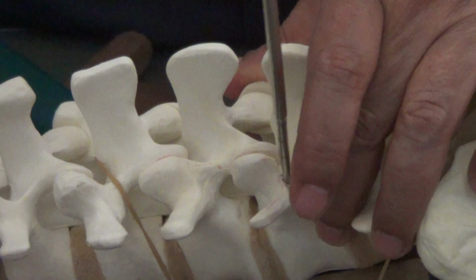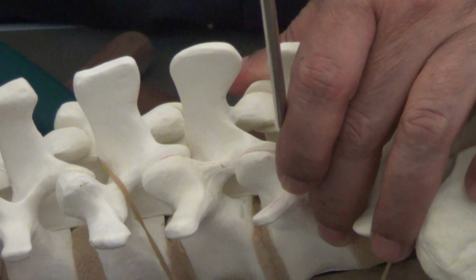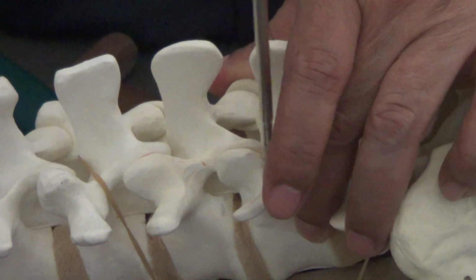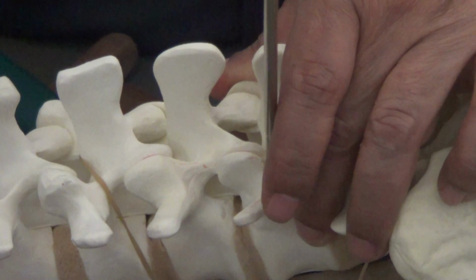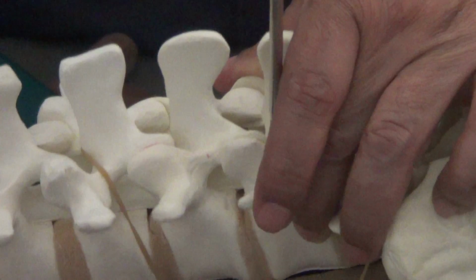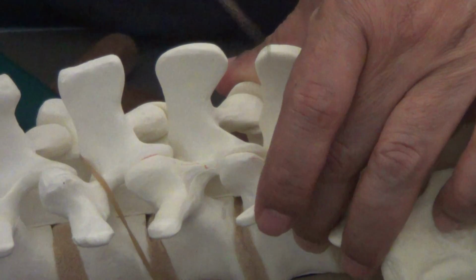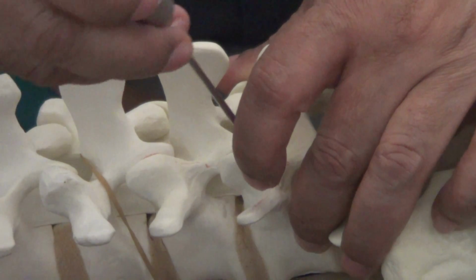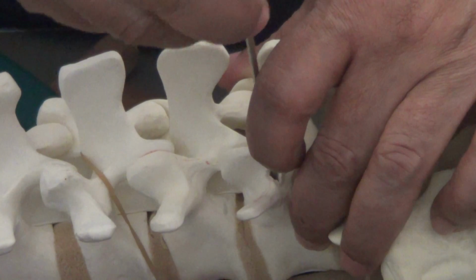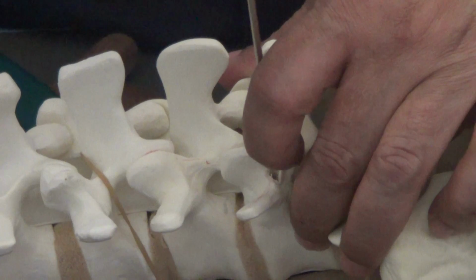Actually, the best way to judge it, often you don't remember it, is we have the lateral view in front of you. You can see what exactly is your angle there. So you go in about 20 millimeters, and then you would have crossed the pedicle by then. And then what is very important, that you sound your hole, right? So you scratch the medial border. You should be feeling the medial border there. Outer border, superior border, inferior border.